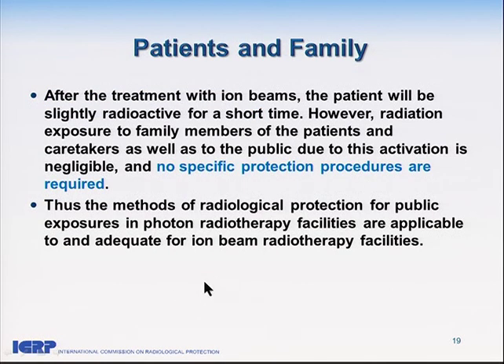How about the patient and family? Well, as I said, after the treatment with ion beams, the patient will be slightly radioactive for a short time. But again, we estimated the dose, and no specific protection procedure is required. It's far less than 1 millisievert in total. Thus, the methods of radiological protection for public exposure in photon radiotherapy facilities are also applicable to these ion beam radiotherapies.